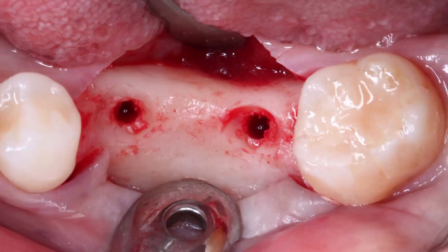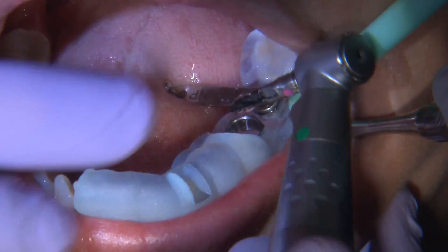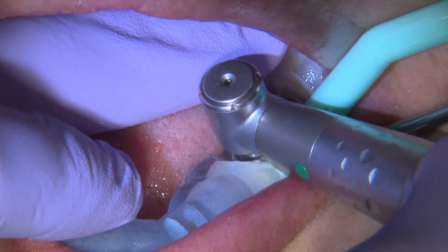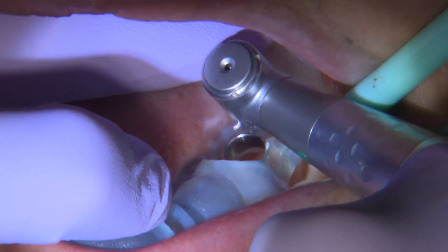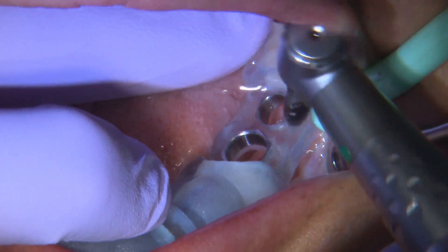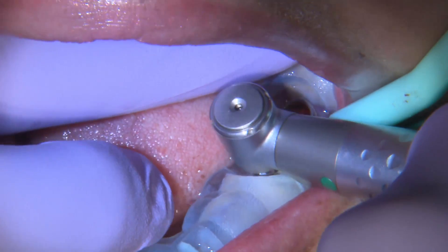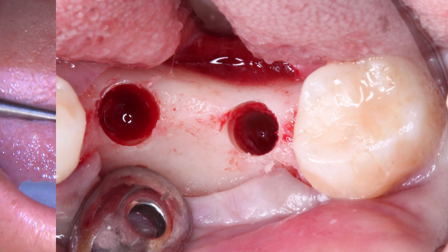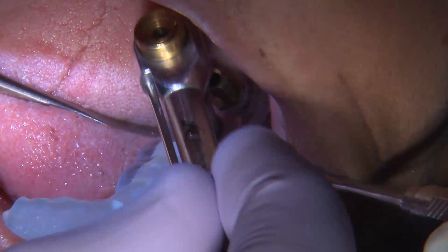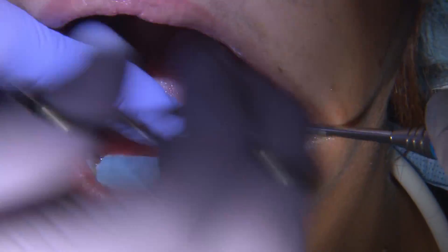Here you see the initial osteotomy after the round drill and start drill. We slowly move forward in drill sizes, increasing the diameter and length until we reach the final point where the drills and implant match. At the same time I'm drilling, I'm stabilizing the surgical guide on the teeth. I've completed the osteotomy and I'm connecting the Han implant to the implant mount. I chose the Han implant because it provides extremely good primary stability and excellent bone retention around the cervical area.